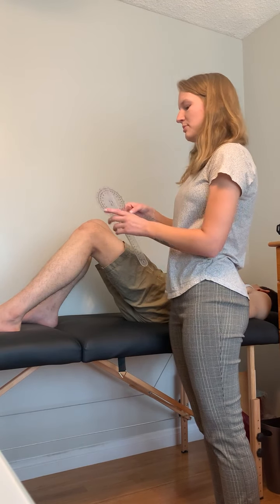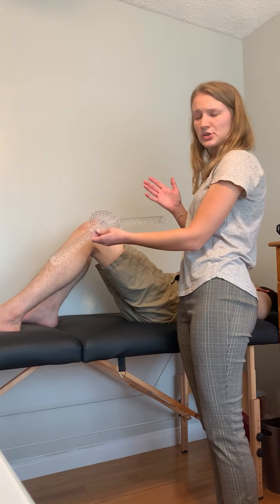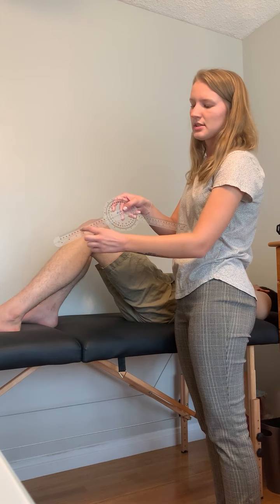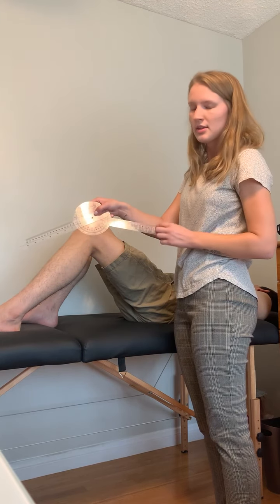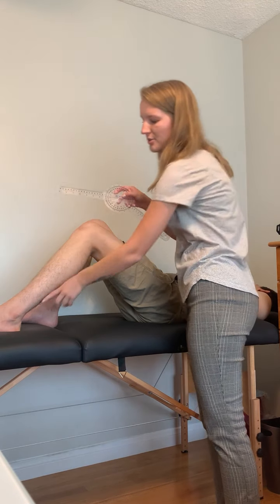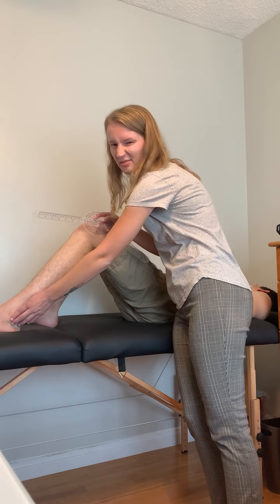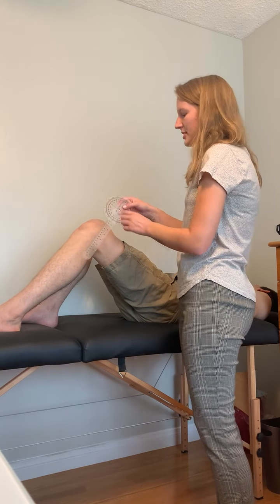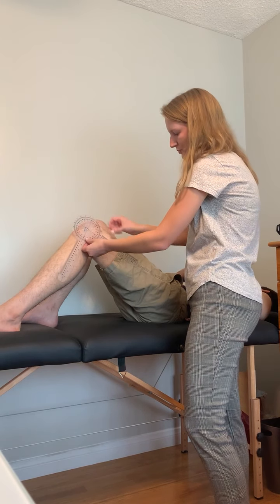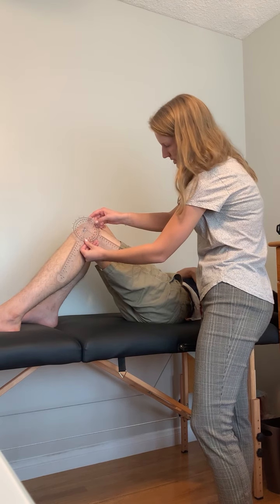And then we're going to be bringing the proximal arm, this arm, closer to the trunk. That one's going to be pointing towards the greater trochanter. You can see these lines on each of the arms. We want to make sure that we're going straight through the middle of the greater trochanter and through the middle of our lateral malleolus, which can be easily found just by looking at it. So we're going to take our axis, line it up with our lateral epicondyle, and then the proximal arm is going to line up with the greater trochanter.